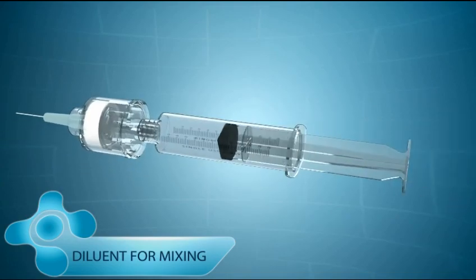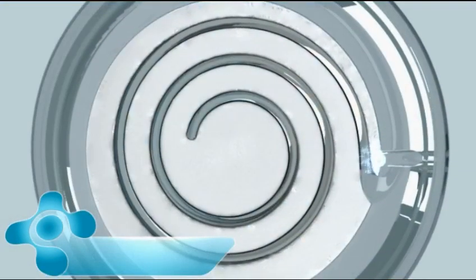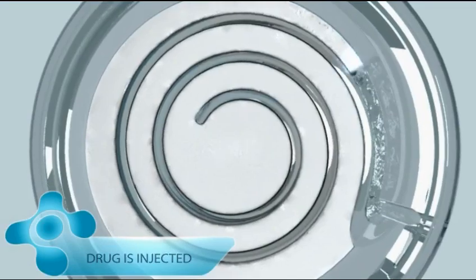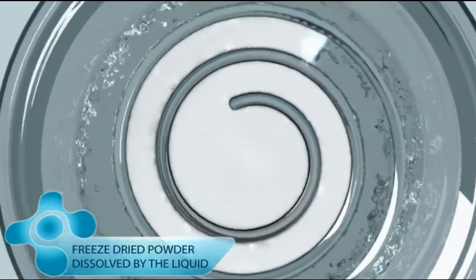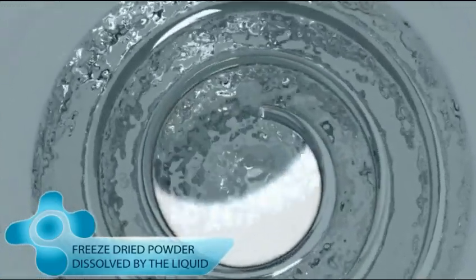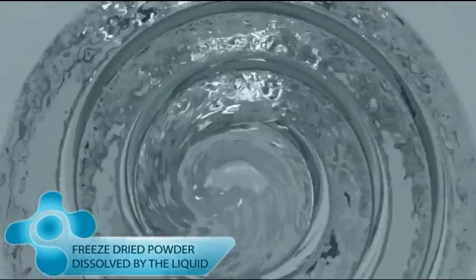When the plunger is deployed, liquid diluent flows through the top of the Liotip and into the spiral channel. The freeze-dried powder is immediately dissolved by the liquid as it moves through the spiral pathway and the reconstituted drug is injected into the patient.